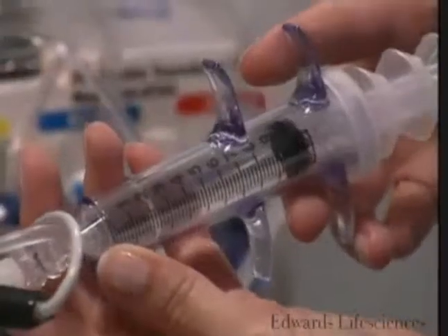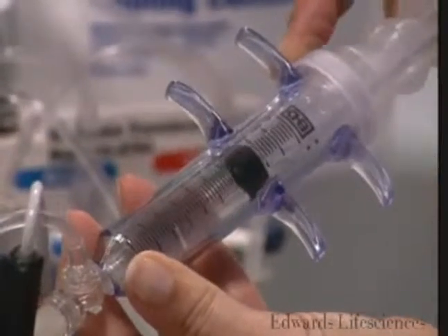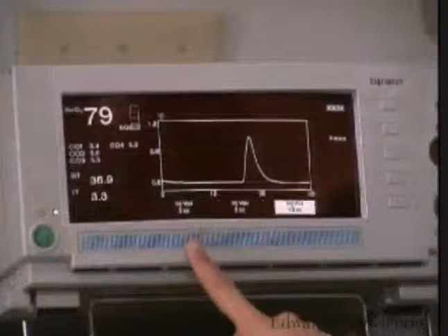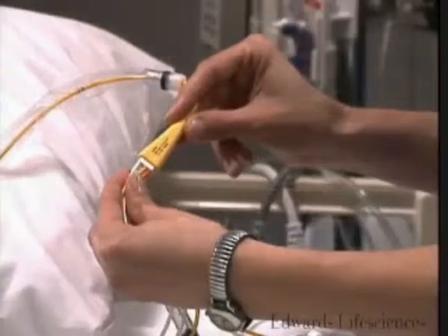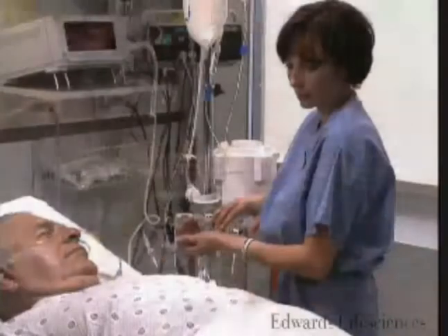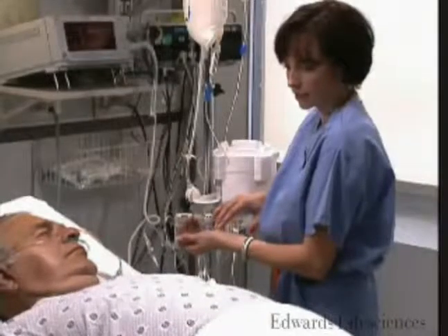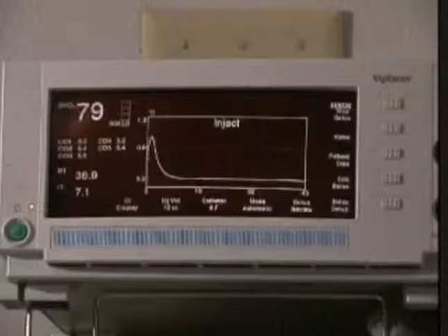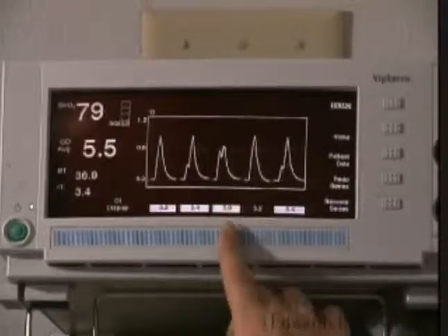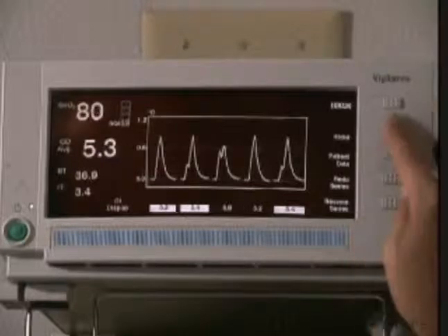Accurate volume of injectate. Be careful when filling the syringe and ensure that the proper amount of injectate is used. Appropriate computation constant. This is based on the size of the catheter, injectate volume, and temperature of injectate. Consistent timing of injection. End expiration is used for reproducible values, and apply a consistent averaging strategy. Averaging should include at least 3 serial determinations within 10% of the median value.